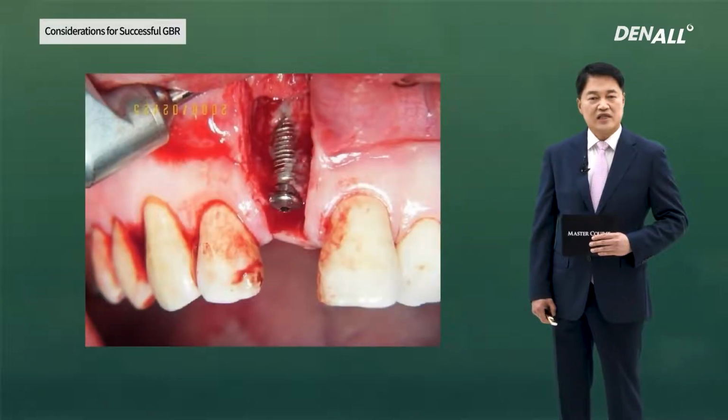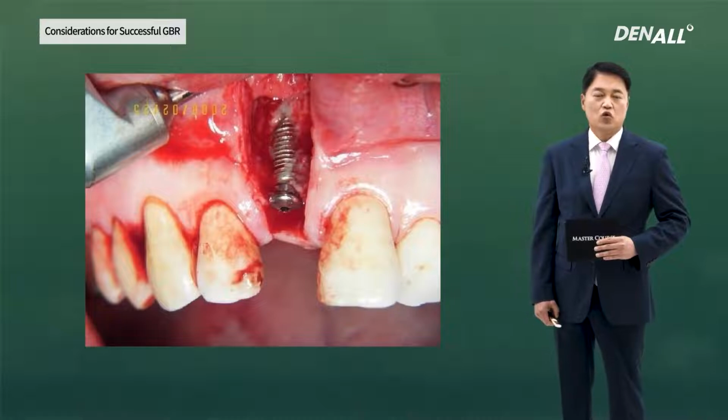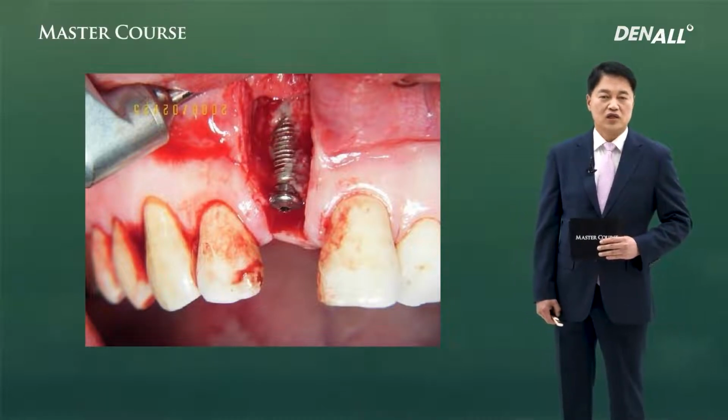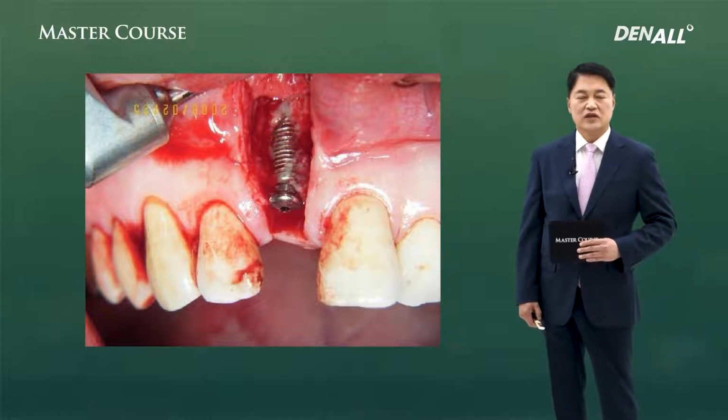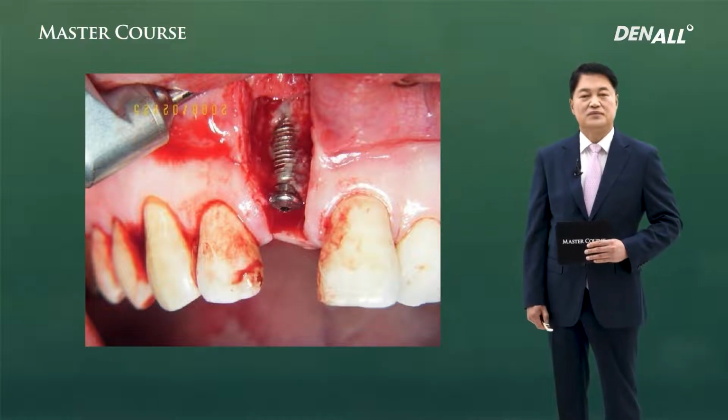This is at second surgery, and this is the image. If you fail to do appropriate GBR, you can get these disastrous cases. And for successful implant placement, appropriate GBR is essential.